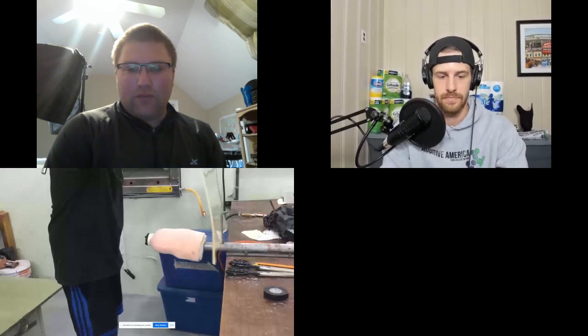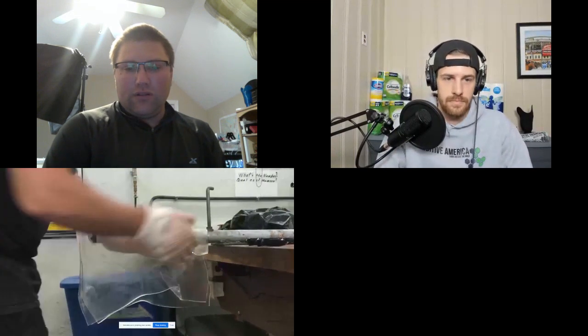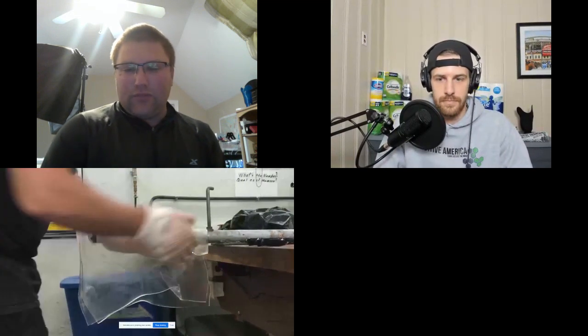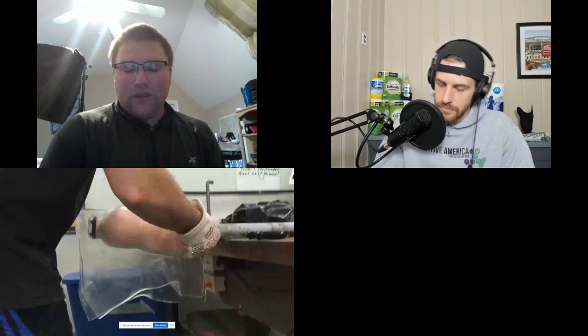What we do is we heat up plastic. This is actually in the jungle of Guatemala. That plastic gets really floppy, and then we pull vacuum on it, and it vacuums down to the mold. After that, we trim that hot plastic off with scissors, finish it with some various grinding tools, and off we go.